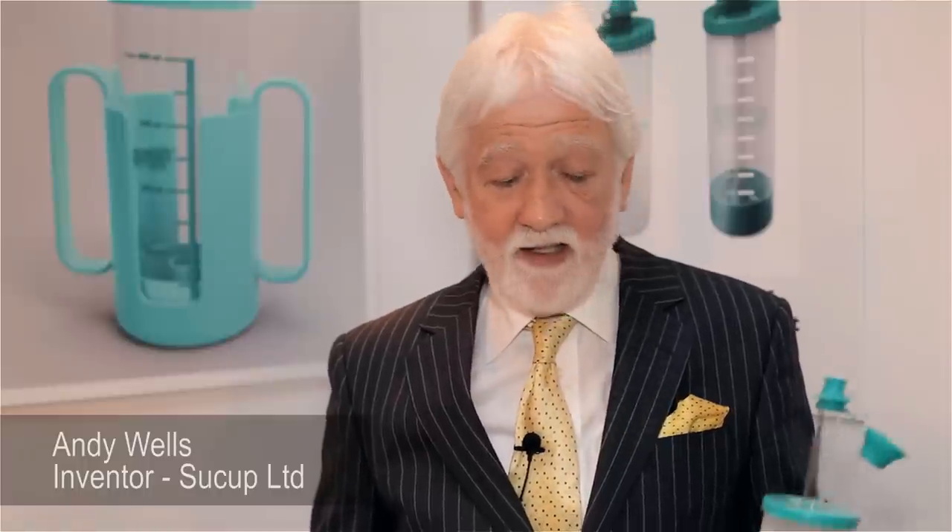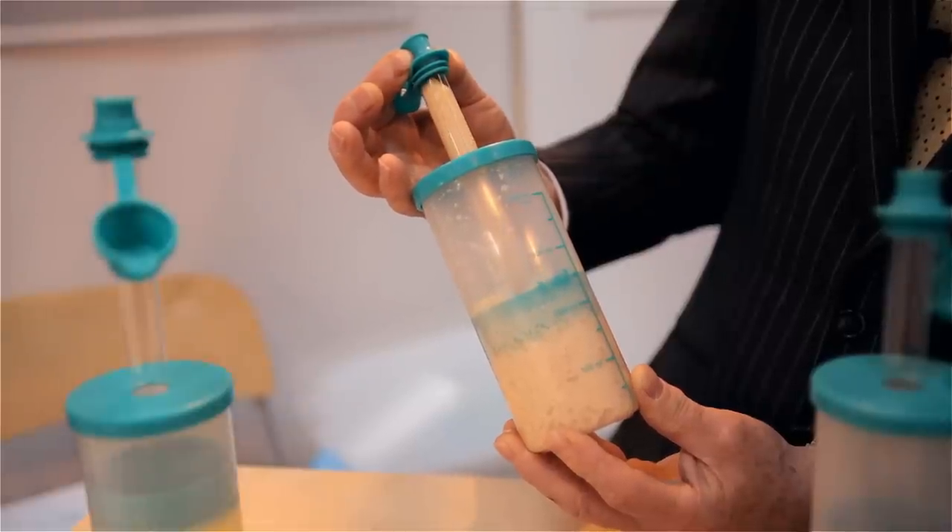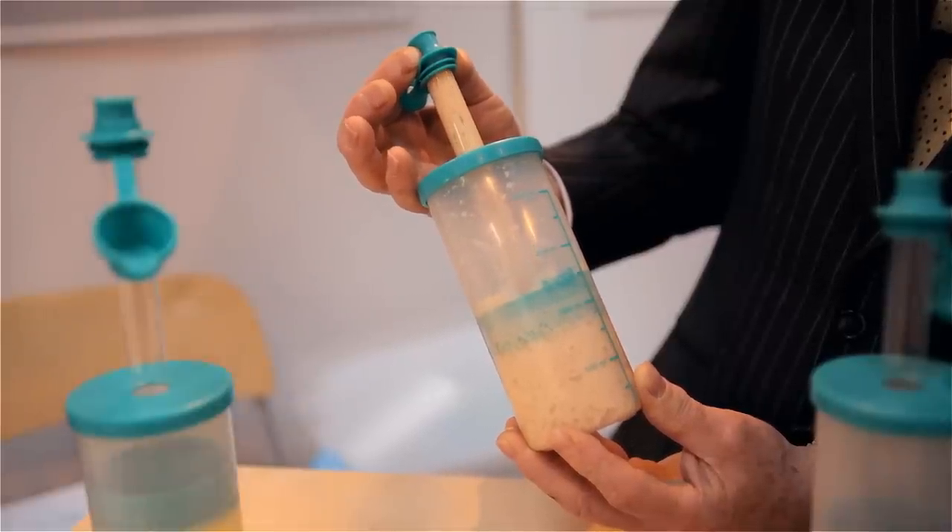I'm here with Andy Wells, Director of Sucup. So Andy, can you tell me a little bit about Sucup? Well, Sucup is for food and for people that have difficulty with knives, forks and spoons. It's a simple product using vacuum technology and of course it won't spill. That's the important thing. So it's good for people in bed and for people with strokes that have difficulty swallowing.